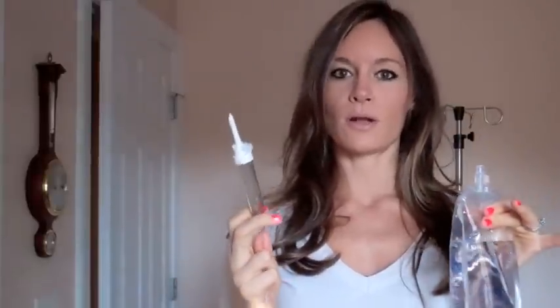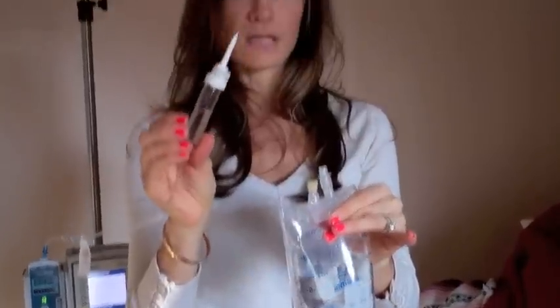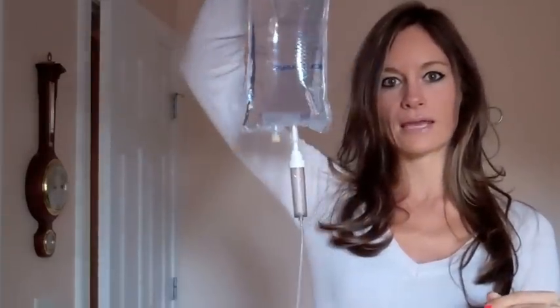First thing you want to do is take the spike here and insert it into the fluid. Make sure you have it pointing up, because if you point it down you're going to have fluid leak. This tip right here needs to remain sterile before priming. Then you want to make sure the tubing is locked, and then you can hang it up just like this.